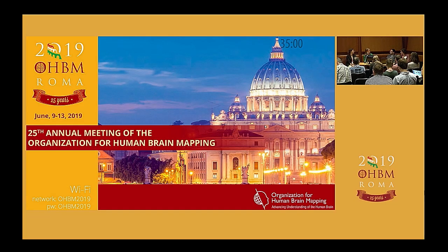You mentioned the distortions during your presentation, and I was wondering what you thought about the relative benefits of 3T and 7T for diffusion imaging, and how one might best QC that choice. That's a very good one. So I'll be very brief about that. Obviously, if you go to higher fields, some of the distortions are way bigger. Especially the inhomogeneity, sometimes you can't even see the temporal lobes, like they're gone. The signal is gone.